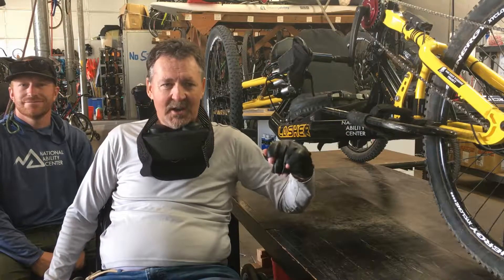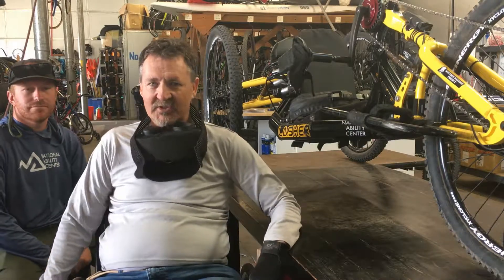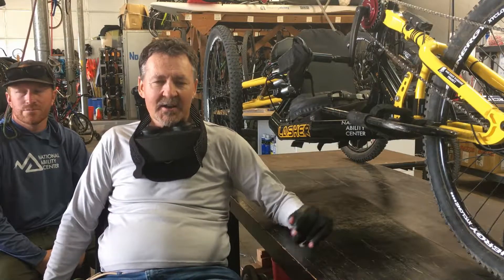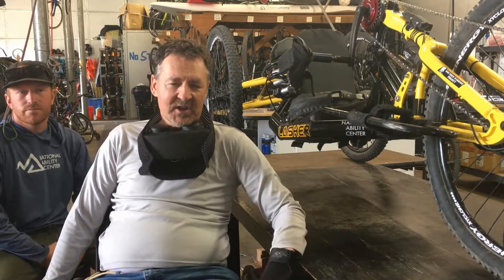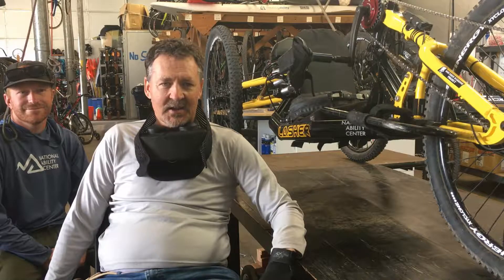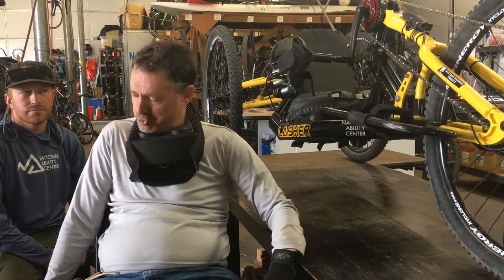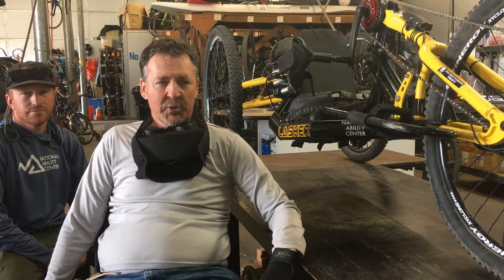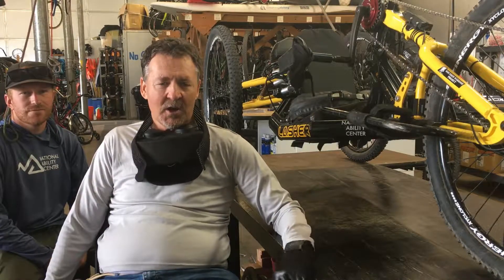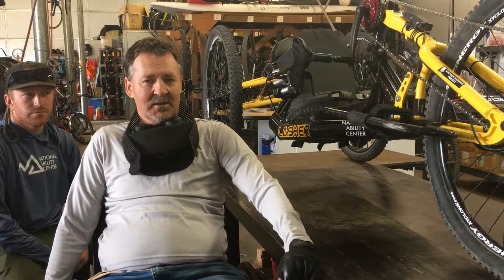My name is Jeff Page and I'm a C6 C7 quad. I'm here today at the National Ability Center with Jared, their head bike specialist. We're going to be talking about a Lasher full suspension hand cycle that we just modified so that it has power assist and wireless shifting. That goofy thing on my neck is my shifter — it shifts up and down. We're going to go through the bike and talk about the features and how much better it is for quads and others without hands to ride hand cycles off-road.